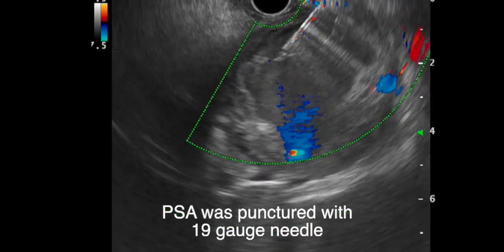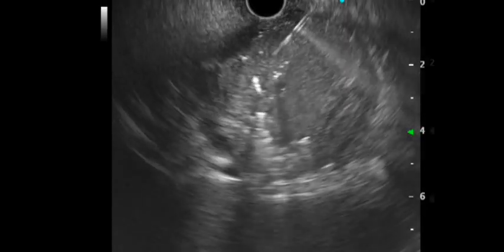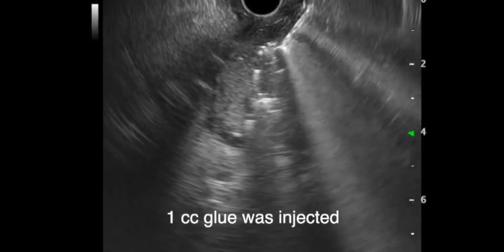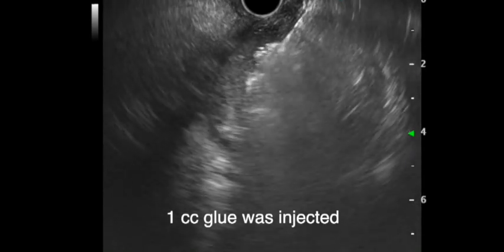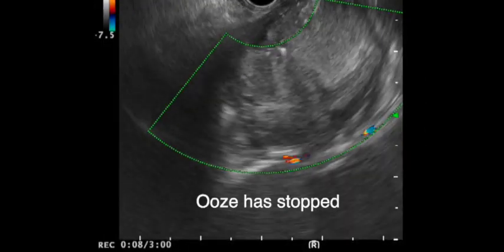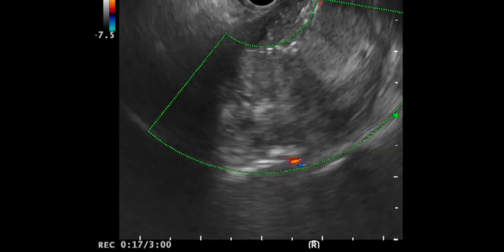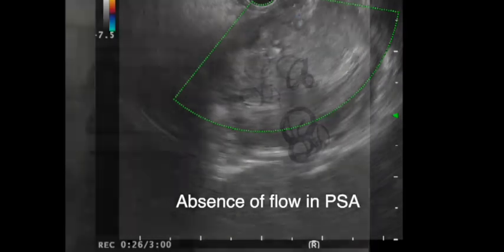As there was no intervening parenchyma, the pseudoaneurysm was directly punctured and multiple coils, almost 8 coils, were deployed. Following coiling, 1 cc glue was injected. Post embolization, absence of oozing from the splenic artery was seen on Doppler flow. Absence of Doppler flow was also seen within the pseudoaneurysm, and this is a fluoroscopy image showing multiple coils.